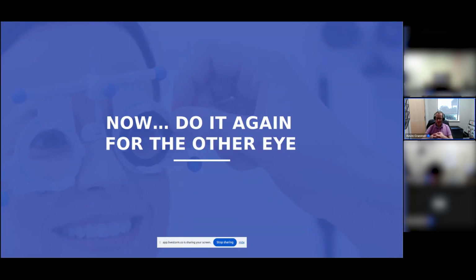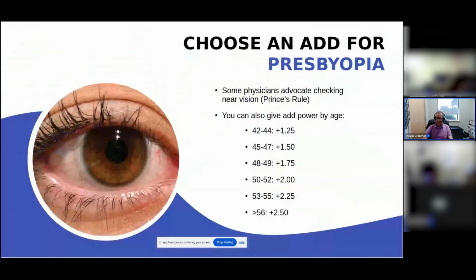You'll basically do the same thing in terms of checking the optics. Once you've determined the distance optical power, and you've determined the sphere, the axis, and the power of the cylinder, you now basically know the prescription. Some practices will want you to check near vision.